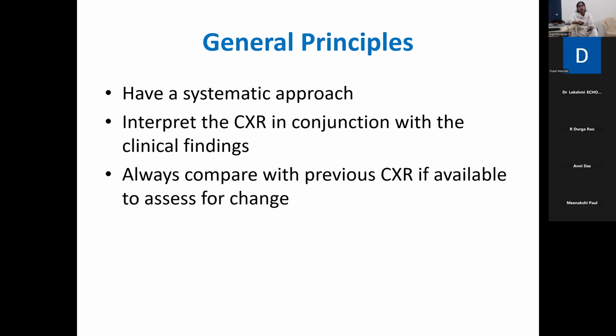The approach towards an X-ray should be systematic. It cannot be haphazard. Most of the time in our practice, I get X-rays on phones from other departments saying interpret this X-ray, interpret that X-ray, or a patient walks in because some other doctor has sent him or her with an X-ray and he just wants me to interpret it. But that is not how it goes. You just cannot take that X-ray and start interpretation.